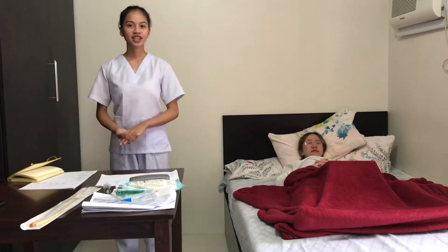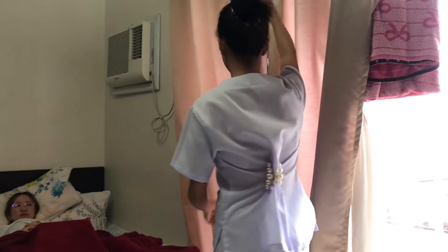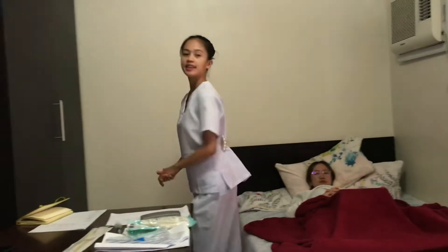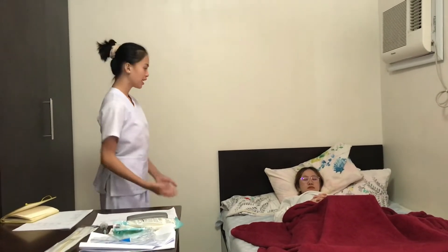And then ensure privacy and provide good lighting. And then position the client into the correct position.